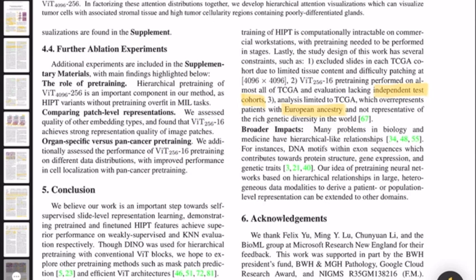It's also important to note that even when using this large data set of thousands of whole slide images, pre-training could only be done at the first 2 stages. They were only able to use fine-tuning for the final transformer stage that learns the slide-level representations. This points to the challenge of data scarcity in computational pathology.